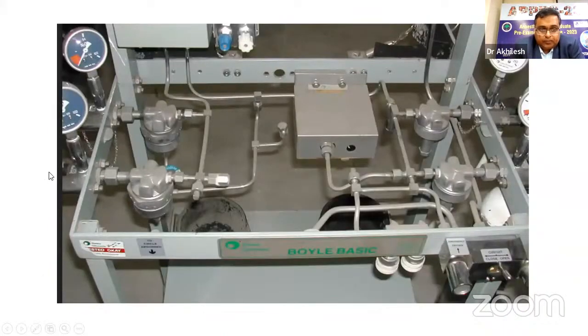Now see this. This is the Bourdon gauge, and this is asked in the exam. These are the pressure gauges. Then these are the pressure control knobs, the pressure regulators, you can call them. And here comes this: the oxygen failure safety device. It allows the movement of one gas based on the flow of the other gas. And then it goes into the flow meters.